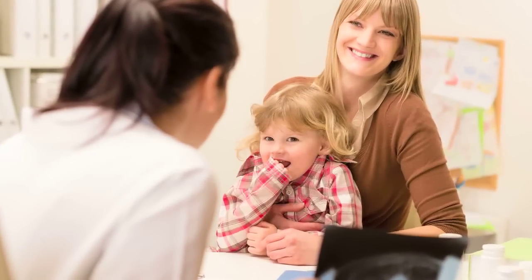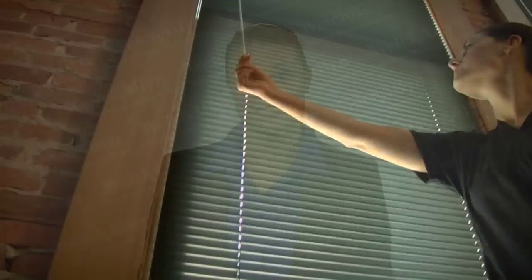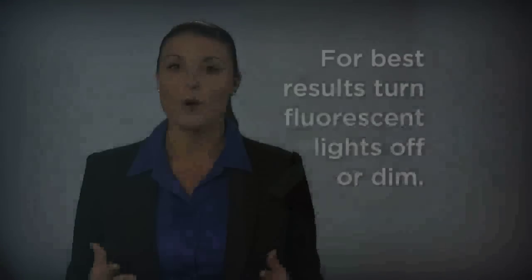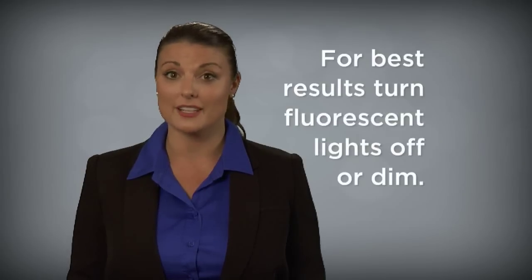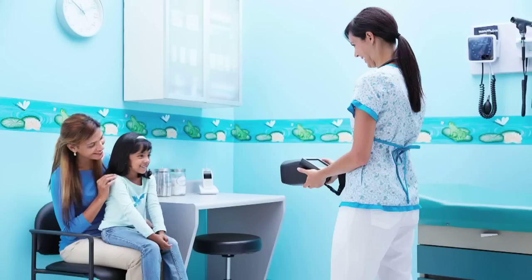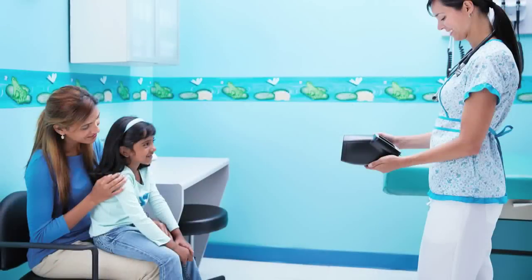Spot is suitable for continuous operation. It can be used in just about any indoor environment — medical and health care offices, schools, churches, community centers, and more. For optimal screening results, use Spot in an environment with low-level subdued lighting. Close the blinds or drapes and turn off any sources of incandescent light. While fluorescent light is acceptable, it can affect subjects' pupil size and can decrease the chances of a successful screening. You will want to set up your Spot Vision Screening at a distance of approximately 3 feet — just a little more than the length of three standard sheets of paper.